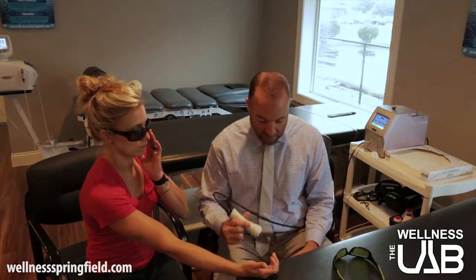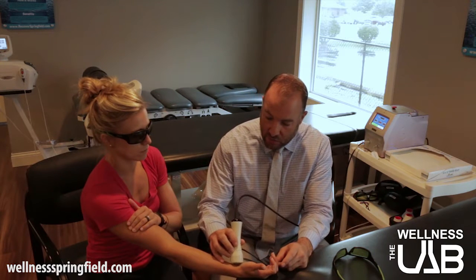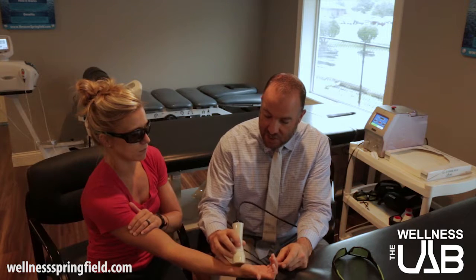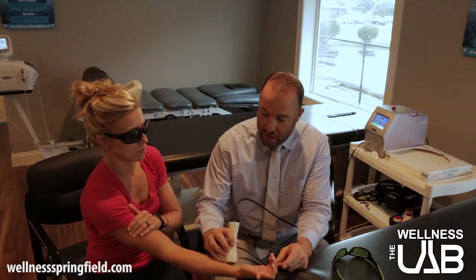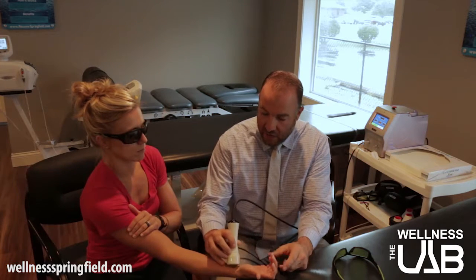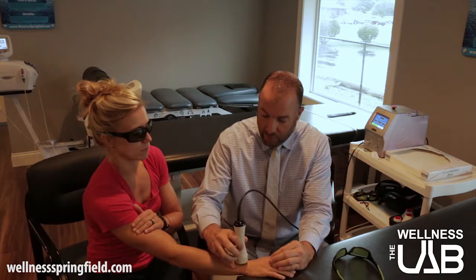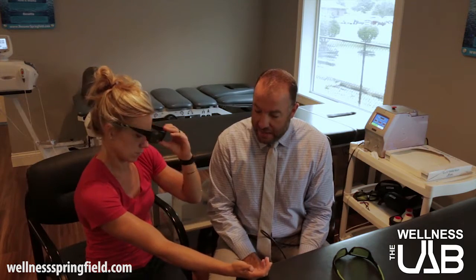So the way this would work is I would put the ball of it onto her wrist, and then we just constantly keep it moving. Since it's such a small joint, this really only takes a couple of minutes to work, and we're just kind of painting the area. Probably do the back just to make sure we're hitting every part of it from all angles. And we do this for about 3 to 5 minutes, depending on the size of the wrist. And that's a really effective way to be decreasing inflammation here in the office.